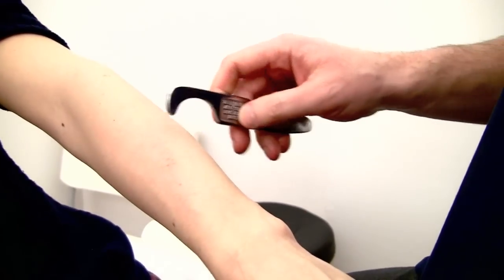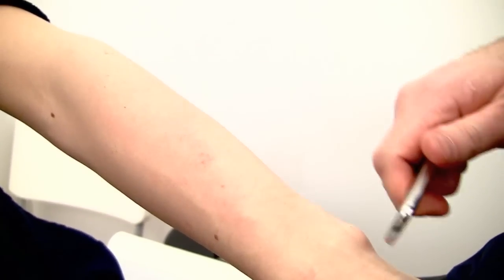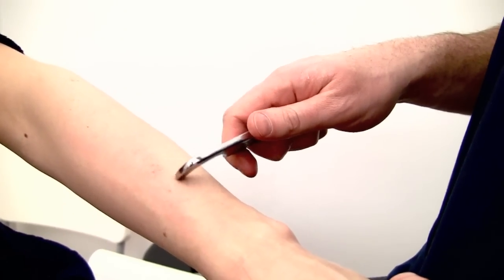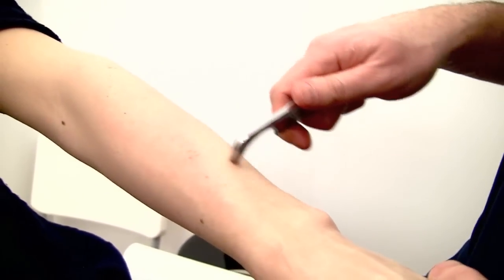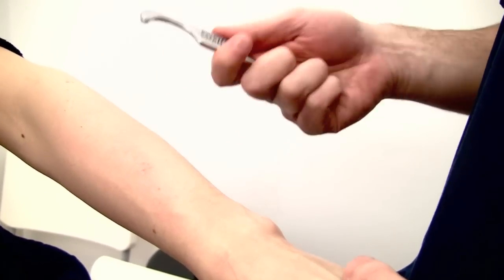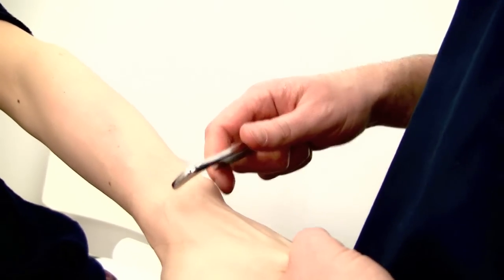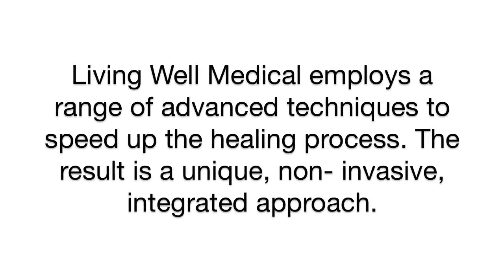Some of the responses you get are inflammatory changes. Specifically, you get petechiae right there. When that comes to the surface, those tend to be more of the trouble areas, and it's normal to see that when you're doing Graston. When the tissue is really bad, you'll see that the entire tissue will be covered and gets really red and inflamed in that region, which for Graston's sake is a good thing because that means we're working the right tissue, and the inflammatory response will actually cause healing to occur at a much faster rate.